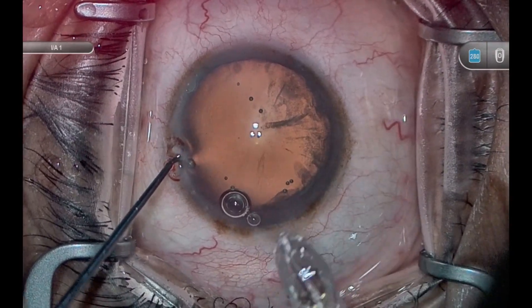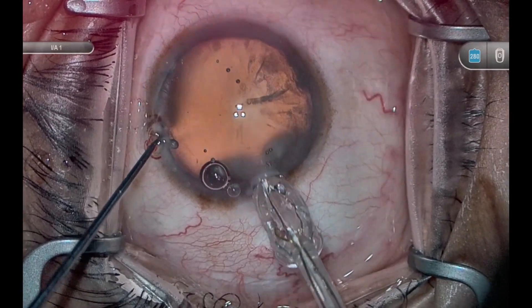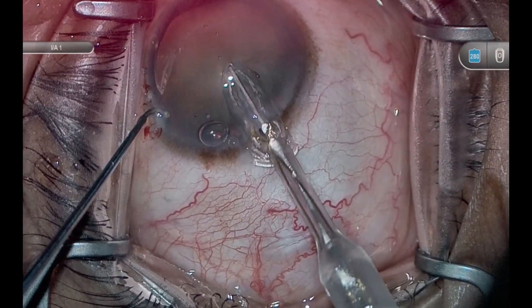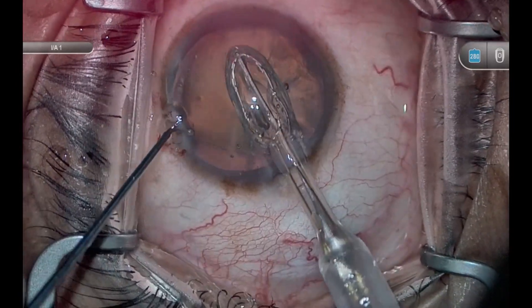Once you're sure, move your slider forward and collapse the tip of the Zeptoe. With a little counter traction with your second instrument, go ahead and gently insert the tip of the Zeptoe through your primary wound. This is going to feel very uncomfortable initially because it's kind of a tight fit. Once you're about halfway through the wound, move your finger from the back part of the slider to the front part of the slider, but don't retract yet. Go all the way in.